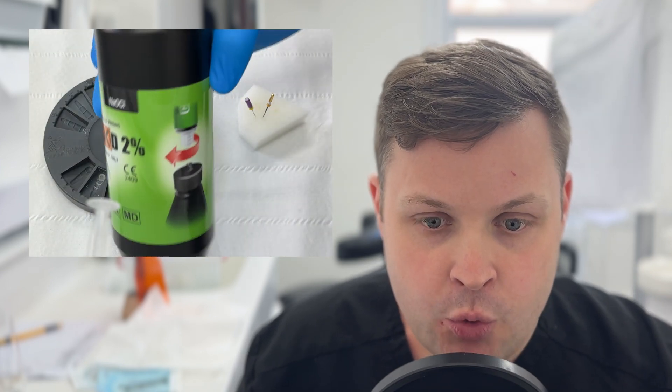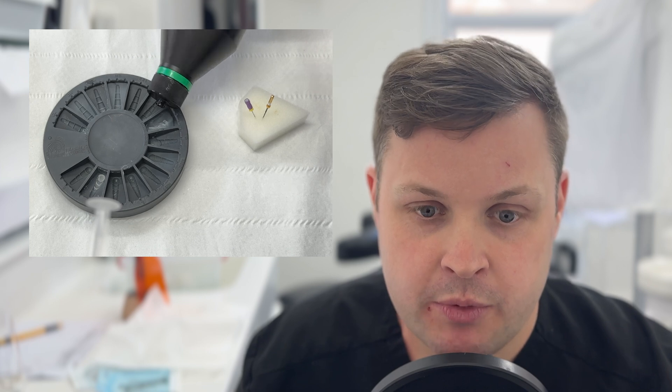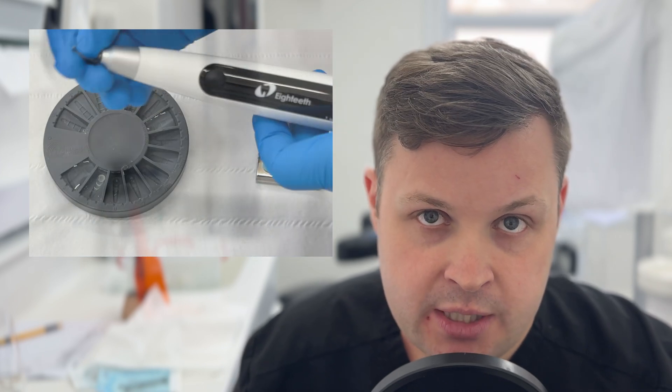So hello, welcome to this week's Friday clinical case. This is a clinical case which is going to go straight back to basics. This is probably my most comprehensive explanation of how I do a root canal, and I've chosen a really simple root canal to do in this case — an upper left two — just to demonstrate every single step I do to carry out a single-rooted root canal.